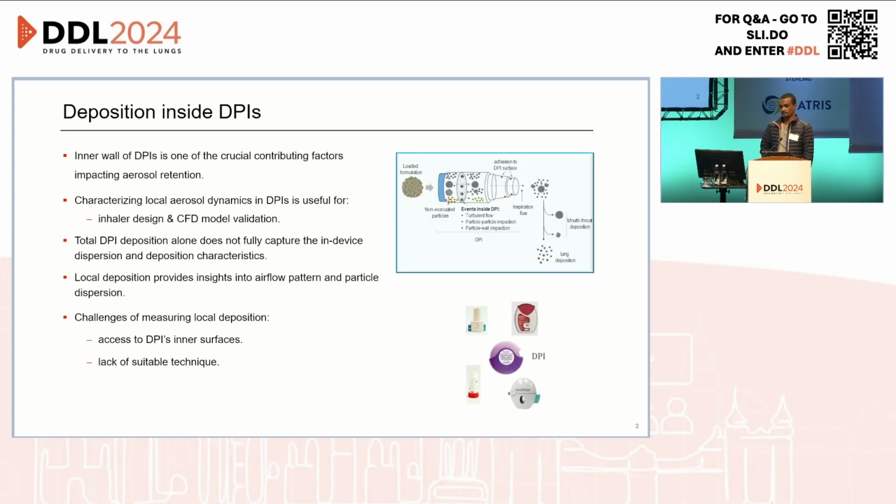It's well known that the inner walls of DPI devices are crucial in impacting the aerosol retention. So characterizing the local deposition inside the DPI is useful to optimize inhaler designs as well as for validation of CFD models.